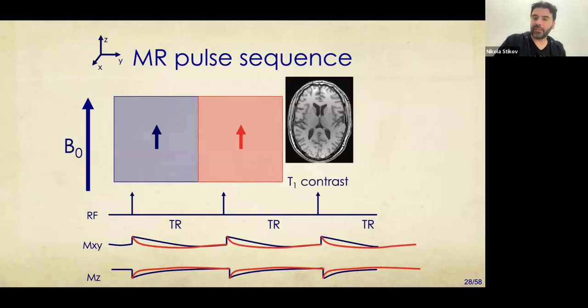And we actually exploit that. And depending on where we do the imaging, we can actually create different kinds of contrasts with MRI. And this is what's very nice about it, that MRI is a very flexible imaging modality, where if you want to focus on certain body parts, you can tailor the sequence to give you those body parts. This image here is called a T1 weighted image.